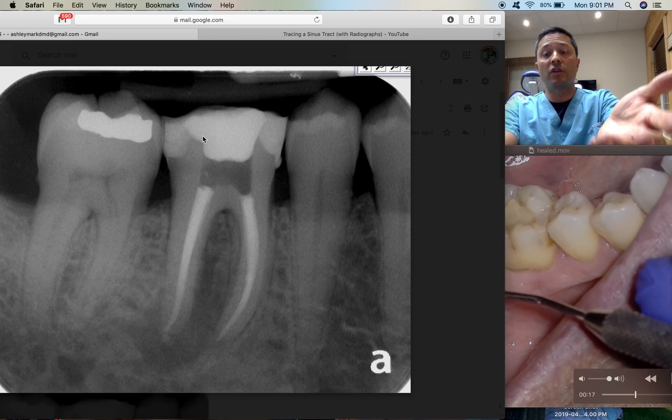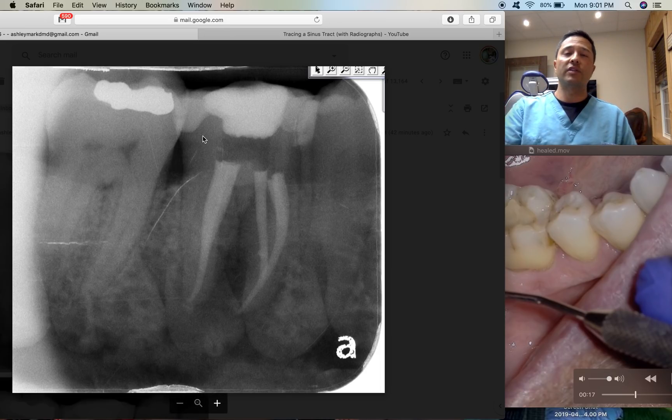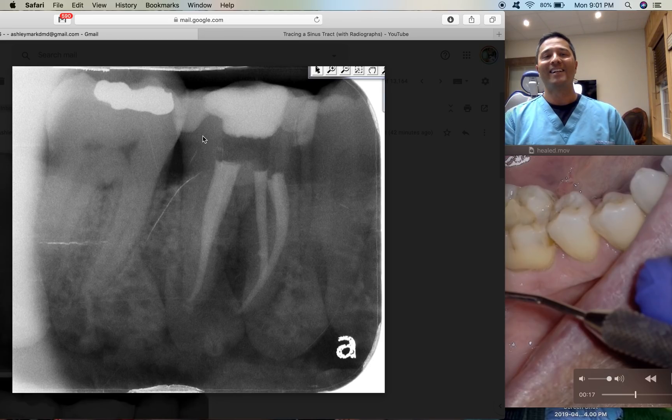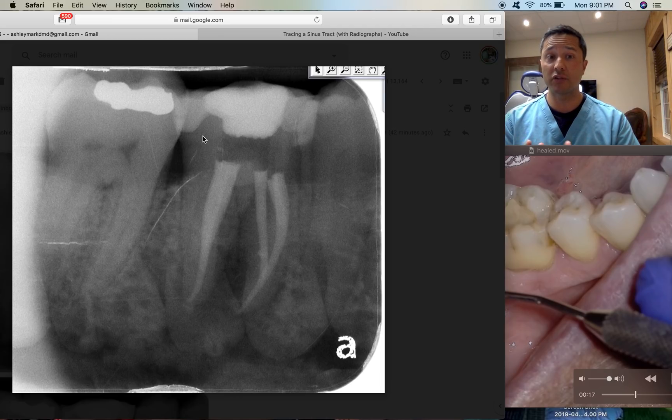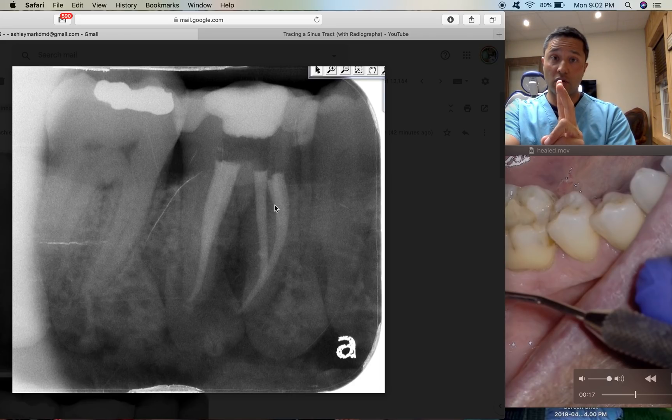In the superimposed mesial canals, you can't tell which canal is which — which is buccal, which is lingual. So I take my shift shot, and my question for you out there is: based on just this x-ray, can you tell me what type of shift shot this is? Is this a distal or a mesial shift, and which canal is which? Based on the SLOB rule — same side lingual, opposite side buccal — are you able to tell me which canal is which?